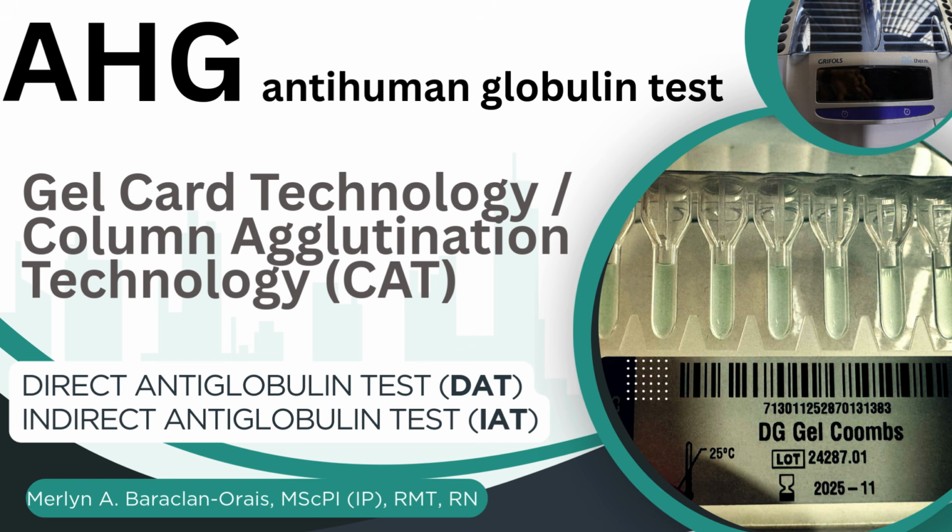Today we're diving into some fascinating immunohematology techniques centered around the antiglobulin tests. So, first, let's highlight the two types of tests. We have the direct antiglobulin test, or DAT, and the indirect antiglobulin test, known as IAT. These tests are essential in checking for antibodies that might be stuck to red blood cells, providing crucial insights into conditions such as hemolytic anemia or transfusion reactions.